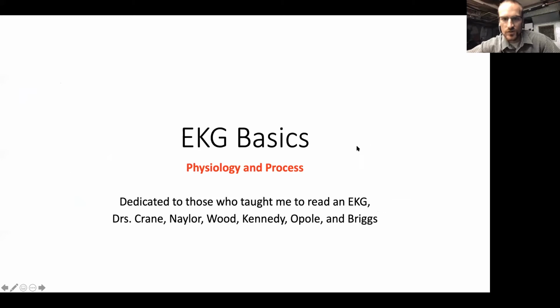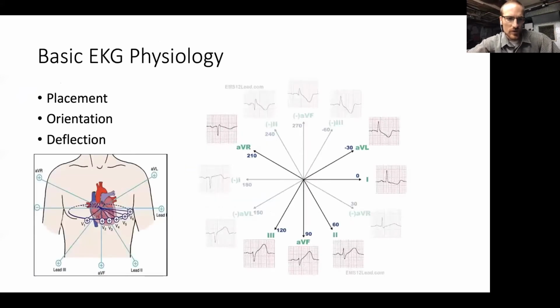All right, are you all seeing what I'm seeing, which is just a great little PowerPoint without any of the other mess from my background? Cool, thanks for the heads up. So EKG basics, physiology, and process. The folks who taught me how to read an EKG, Crane, Naylor, Wood, Kennedy, Apoli, and Briggs, I'm indebted to for this. So basic physiology, you have 10 leads for a 12-lead EKG, big shocker.